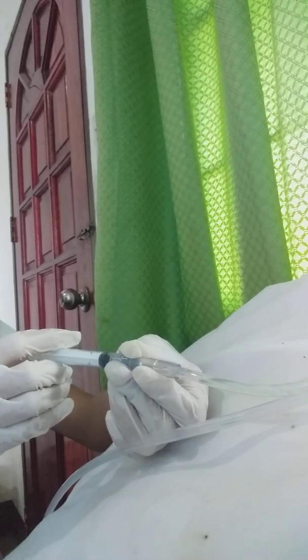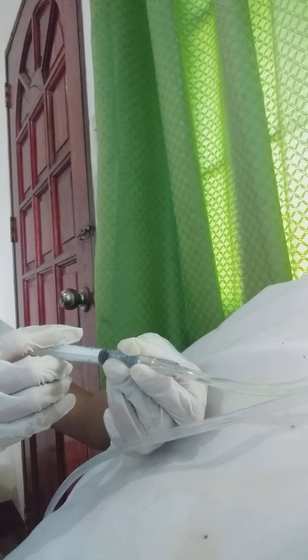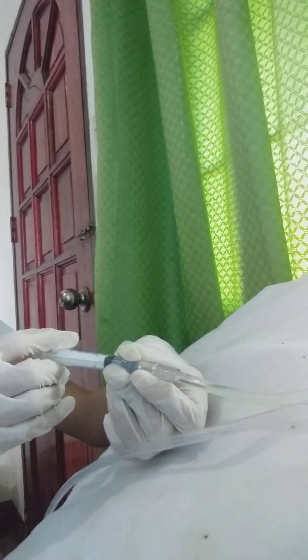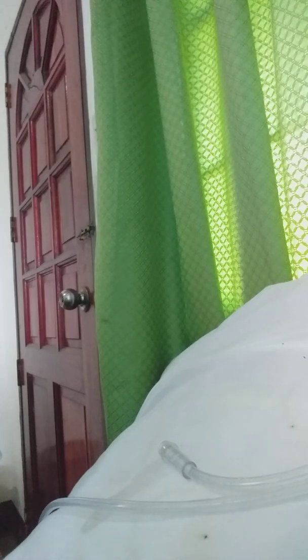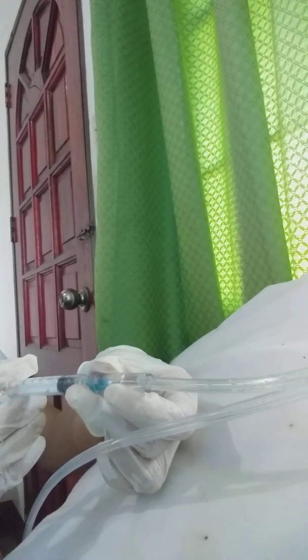Inject the medications slowly at the recommended rate of infusion. Use the push-stop technique for central venous catheters. Then remove the syringe when all medication is administered, and then we have to reflush the IV saline. Repeat the injection with 1 ml saline and remove the syringe, and we have to reflush.